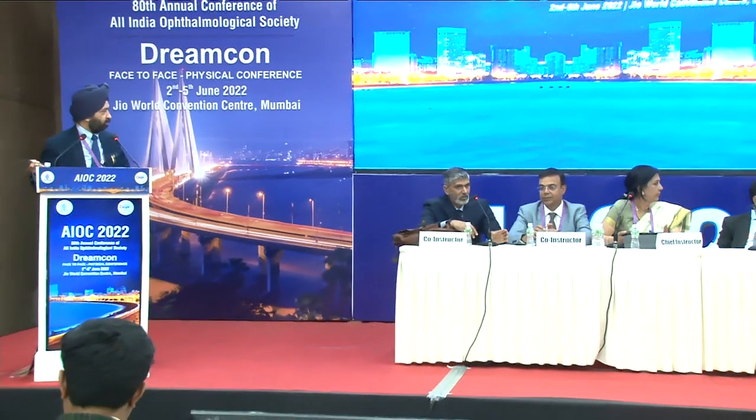Very rarely we're caught in a situation. Would you do PRK on the same sitting? No, I've never done it. I don't know what that situation would be. But basically if you have to and the patient has to go somewhere, but ideally I would wait for the patient if I can't do the procedure at the same time. Patients are really not very happy with PRK, but if you have to, you have to. And if you have a lenticule cut and you do PRK, the incidence of haze is more. So I don't really like that.